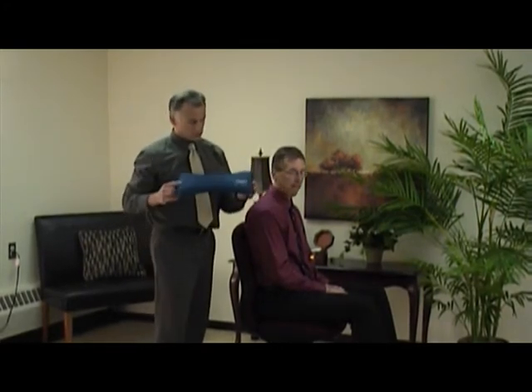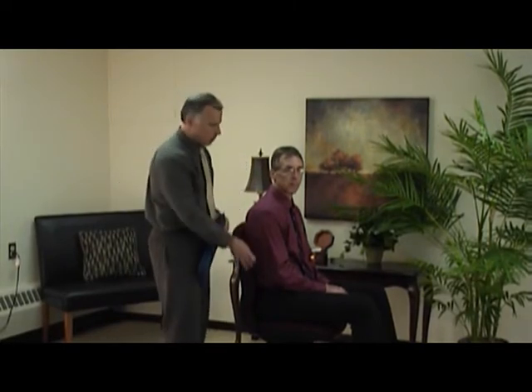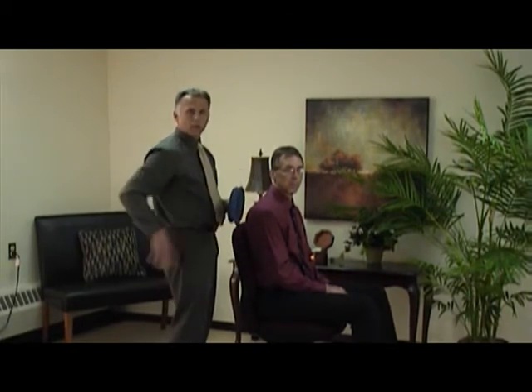Okay, the second lumbar support I want to talk about, I just started using this one about 1.5 years ago. One thing about lumbar supports, we talked about moving it up and down, is the thickness of the support itself. It's like, boy, I wish I could have one that could vary the thickness, and lo and behold, they came up with the variable density or the variable thickness of the lumbar support itself.